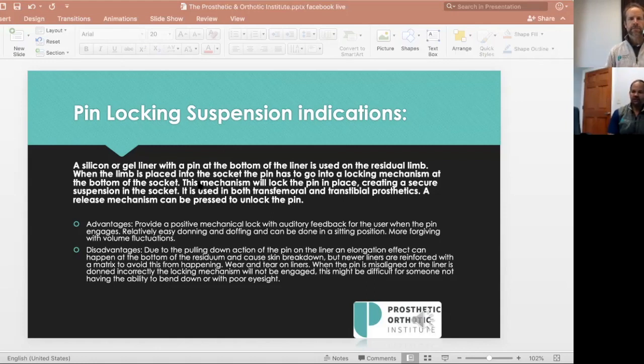That's correct. For below the knee amputees, I often hear, I've got to toughen up the bottom of my residual limb. I've got to get it calloused and hardened up on the bottom so I can walk in my prosthesis. And that was true 40, 50 years ago. But today technology is so advanced. We use what's called total surface bearing sockets, patella tendon bearing sockets, hydrostatic unloading sockets. And as a result, we no longer have to be concerned with weight bearing on the residual limb at the very bottom where the amputation has occurred.